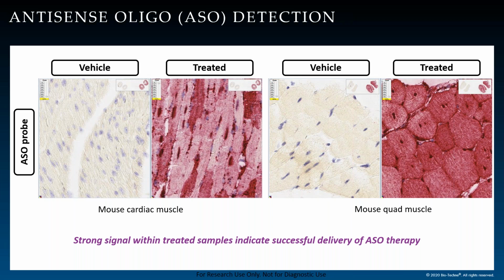Again, using this information, one can then ask more questions. So this is actionable data that you can act on, formulate new hypotheses, and try to understand how you can improve antisense oligo delivery by adding modifications, conjugating the ASO to be delivered specifically to a particular tissue of interest. You can also study biodistribution. Is it expressed in a particular tissue, or is it more systemically delivered into the different tissues within the animal? And the other questions that can emerge from here.